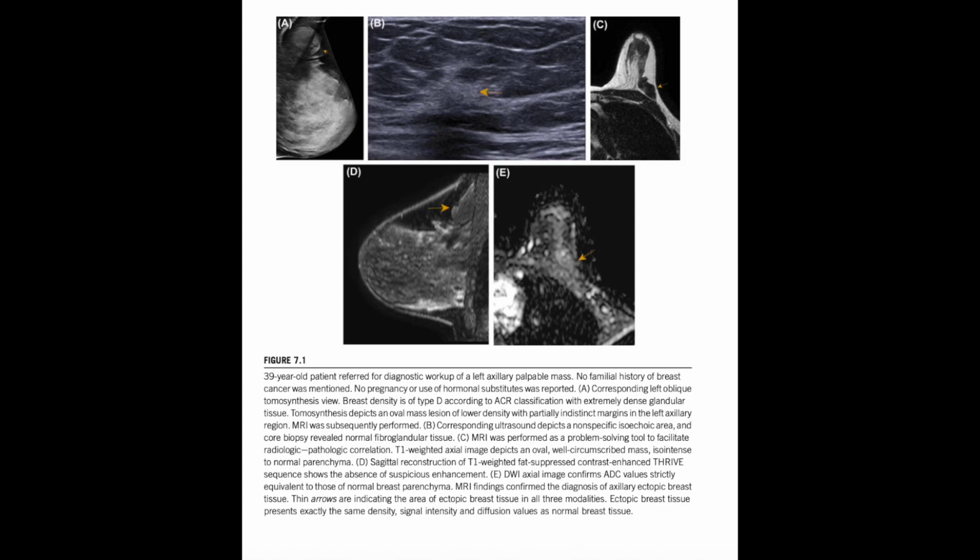Today we're plunging into a really important topic in breast health, specifically looking at MRI. We're going to break down the characteristics that allow a physician to look at an image and say, with confidence, this is benign. Exactly. And our mission today really is to give you a kind of shortcut. We're navigating Chapter 7 of the source material. The goal is to pinpoint those key features that let you confidently categorize a finding as benign and, ultimately, help avoid an unnecessary intervention like a biopsy.